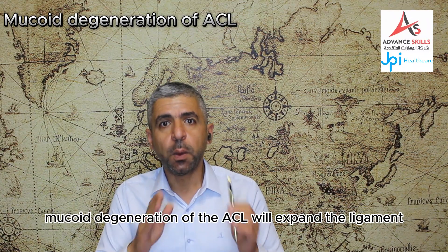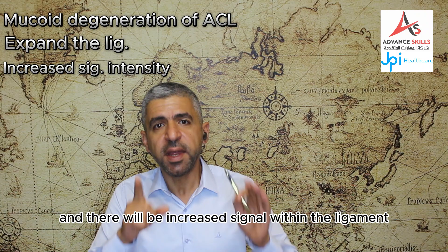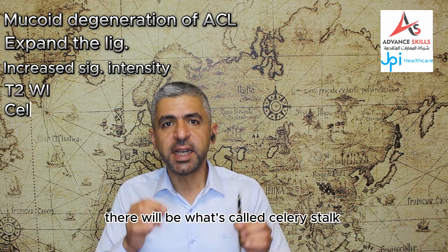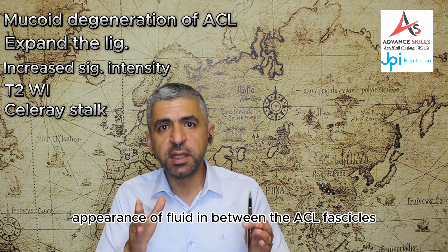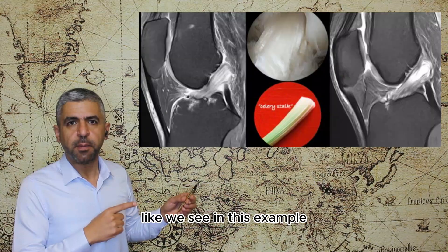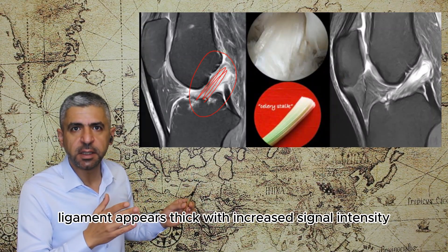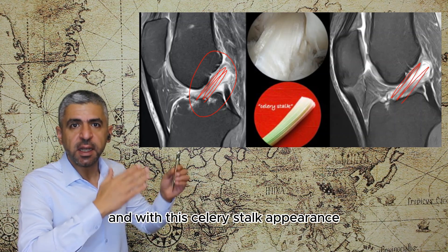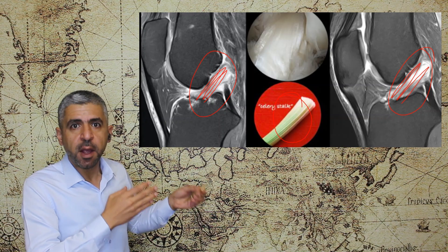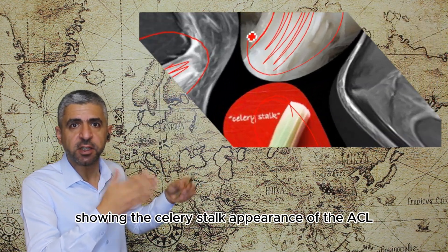Mucoid degeneration of the ACL expands the ligament with increased T2 signal within it, producing a celery stalk appearance of fluid between the ACL fascicles. On this example, the anterior cruciate ligament appears thick with increased signal intensity and celery stalk appearance. An arthroscopy image also demonstrates the celery stalk appearance of the ACL.